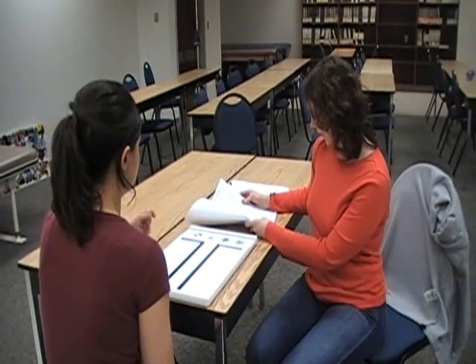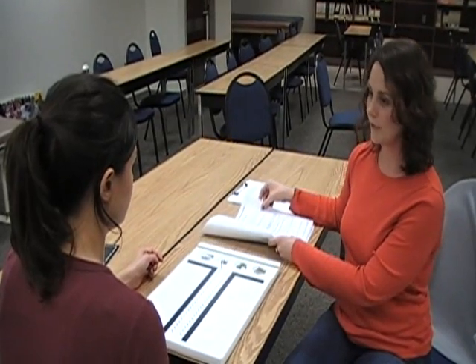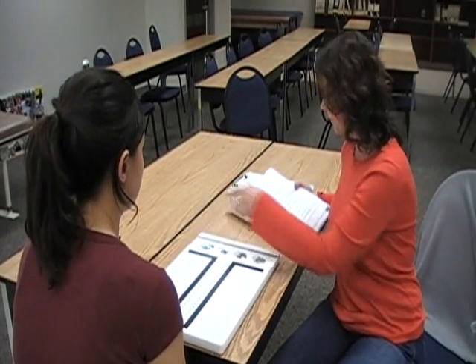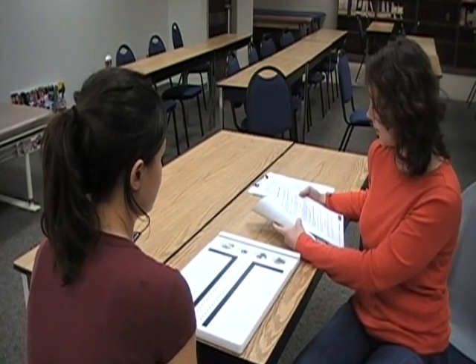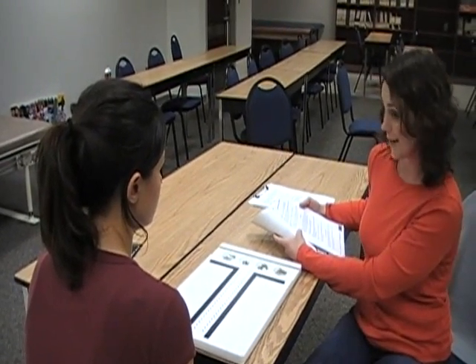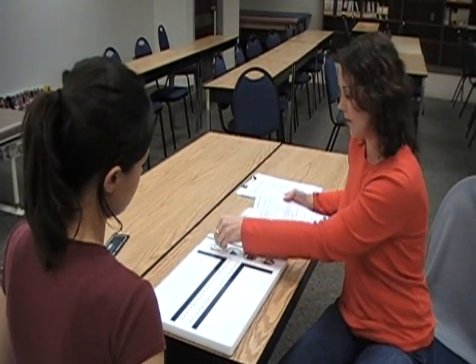For the left hand test, also 30 seconds. Say: 'Pick up one pin at a time with your left hand from the left-handed cup. Place each pin in the left-handed row, starting with the top hole. You may insert a few pins for practice.' Let them practice, then say: 'Now take out the practice pins and put them back in the left-handed cup. When I say begin, place as many pins as possible in the left-handed row, starting with the top hole. Work as rapidly as you can until I say stop. Are you ready? Begin.' After 30 seconds, count the pins and record that as the left hand score.